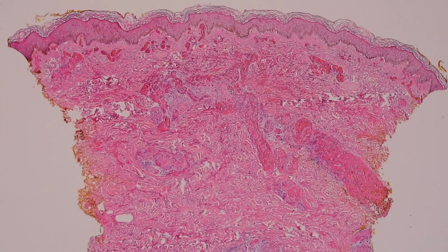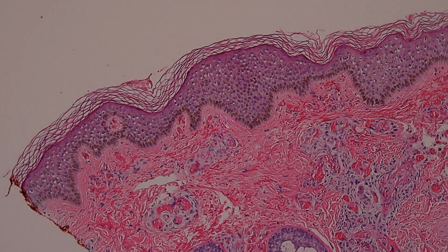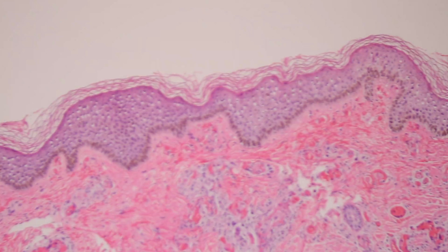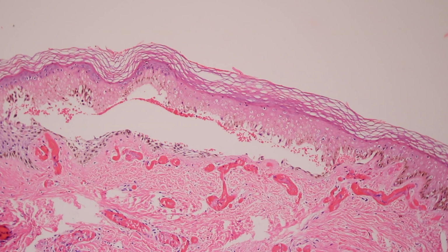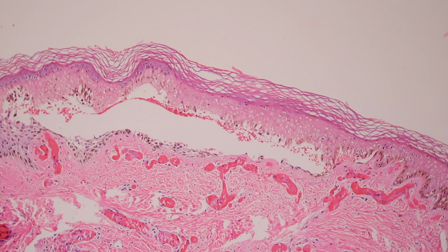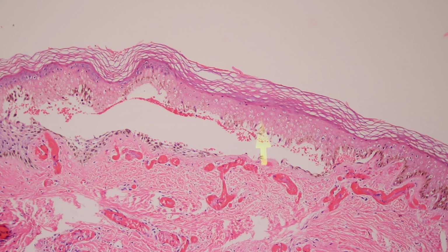So this is a nice example, again, of what I was showing you in the other biopsy. Let's see if there's any normal. This is relatively normal epidermis here. And watch what happens as we transition over. It totally ghosts out and becomes pale. Just like that last case, look what's happened. The epidermis is dying because of ischemia, loss of blood flow.